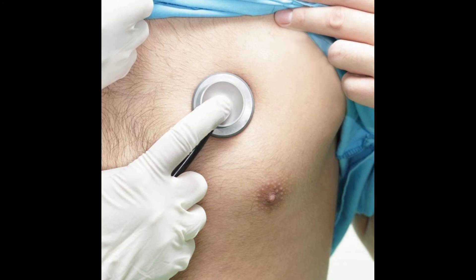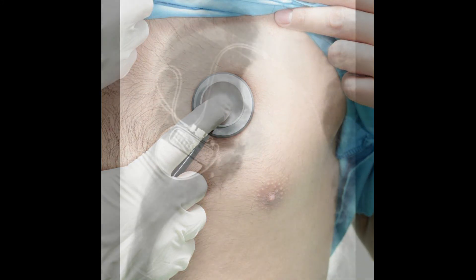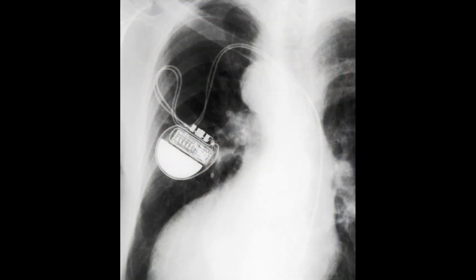The precise technology that goes into making these tools changes somewhat regularly. But generally speaking, the main goal is to monitor the strength and frequency of heartbeats, then trigger changes as needed for a person to maintain optimal cardiovascular health. A DDDR device is specially designed to regulate both chambers simultaneously, which means that it must be situated somewhat centrally so that a lead can enter each chamber relatively easily. Depending on the patient, the leads may be of different lengths.